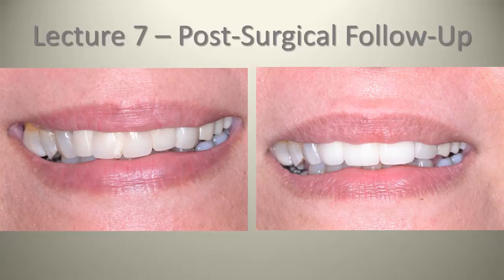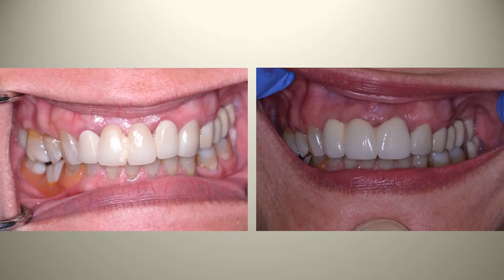So once again, the original case on the left and the final outcome on the right. And in the next picture, you'll see basically an occlusal shot of that correction of that midline for that patient. And she was very happy.